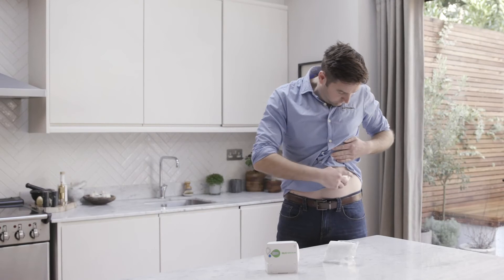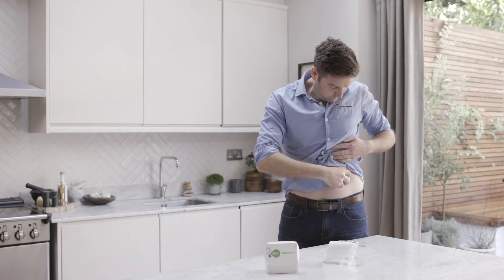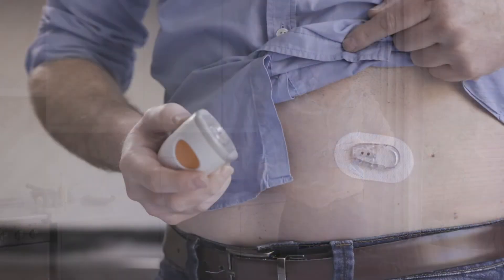The sensor applicator inserts the sensor just beneath your skin. The sensor then measures your glucose levels for up to 10 days.